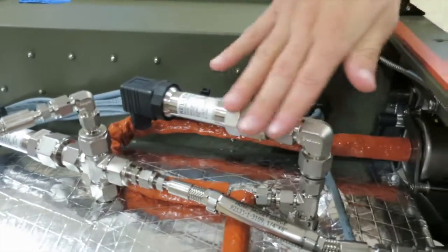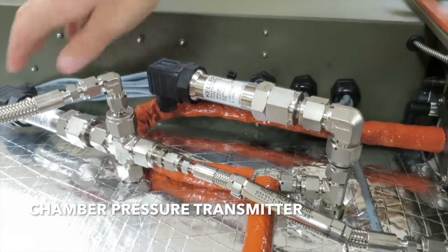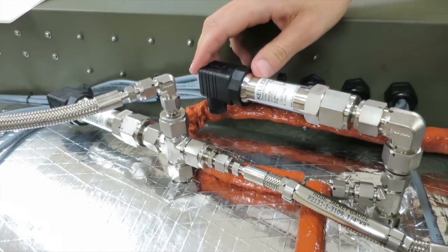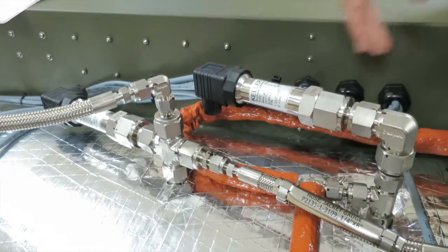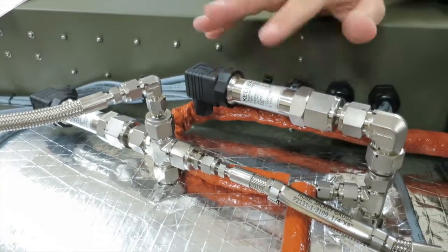This one is the chamber pressure transmitter, and it has that same copper gasket right there. These are actually the same transmitters, so when we send you a replacement part, it'll look identical. It also sends its signal to the PLC, so the PLC knows how much pressure is in the chamber.